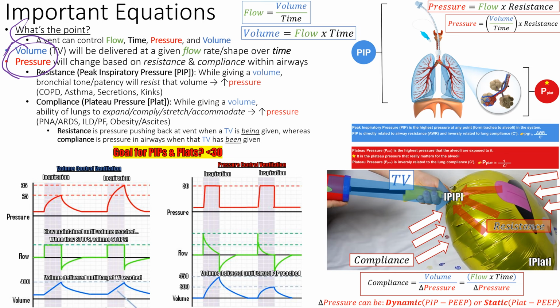So there are flow waveforms, and we found that people like a flow that is nice and sharp, like really quick, right? We don't want to be on the ventilator with a waveform that's all the way slanted, because it's like, give me 400 cc's, hold me just a second, 400, right? They want 400 right away. So with time and research, that's the kind of ideal flow waveform we give them.